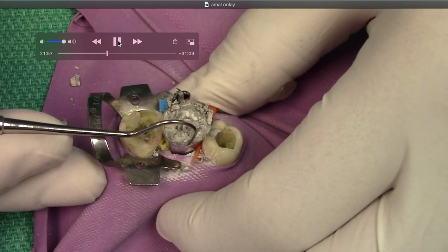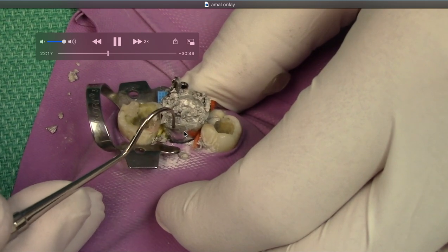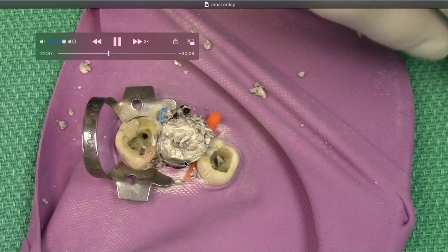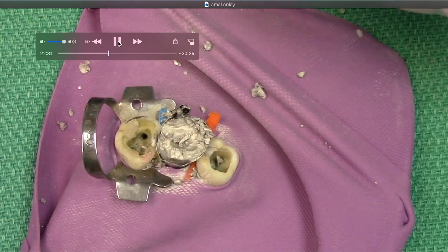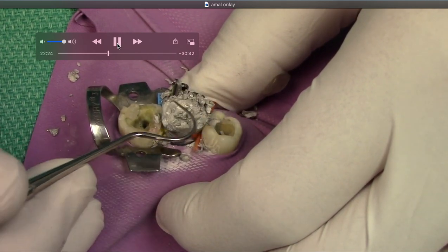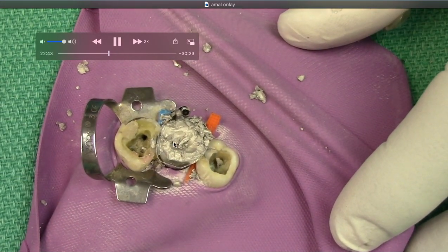Slowing down: the first thing I'm going to do — these are just techniques I've been doing for 20 years — is figure out where tooth structure is on one side. I'm slowly working my way down with my explorer, because we know the band goes way buccally beyond the tooth structure. And yeah, I actually chipped off a chunk with my explorer — which is actually better to show you! I'm going to break off a chunk right here. So it's perfect timing: the amalgam is fresh and I've over-reduced it, so we're going to reprep and add more. This is what you need to do in real life.